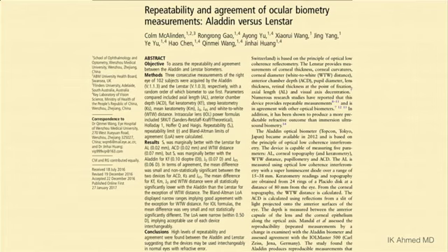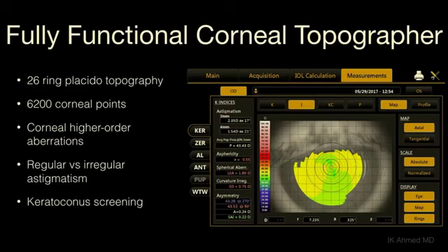So I feel reassured. We did a number of patients on different biometers in our office. We found the same thing as far as reproducibility. So we interchange them all the time. We have really no concern about interchanging them, and I think the studies back us up by that. What's obviously really nice, and again, workflow is important. We do a lot of surgery in our practice with multiple surgeons, multiple formulas, multiple hospitals that we work at and surgical centers, is to have things done efficiently in the office.